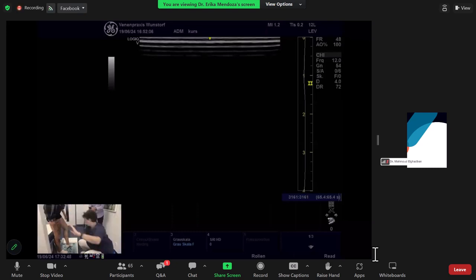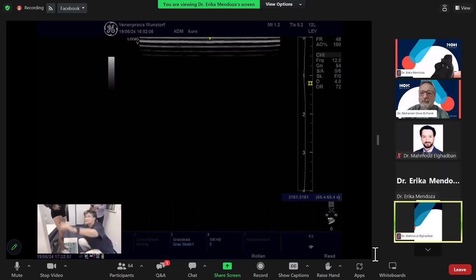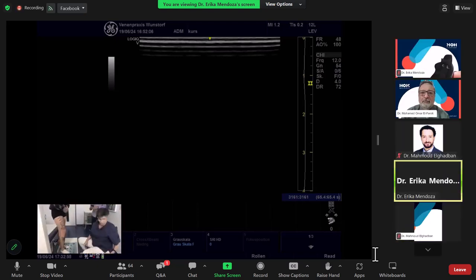But you will be surprised. We'll put this light on. Here is a little tributary, yes? And she came asking for cosmetic help. And as always, before I do this, I make an exploration of the veins inside. So I have put the jelly on my probe, and I start in the groin, right leg.